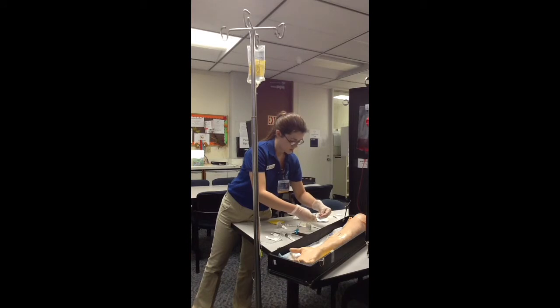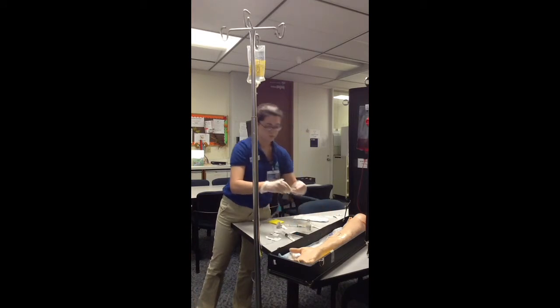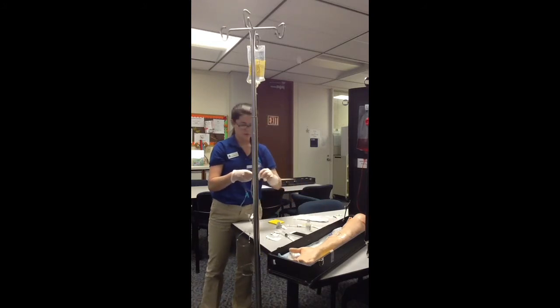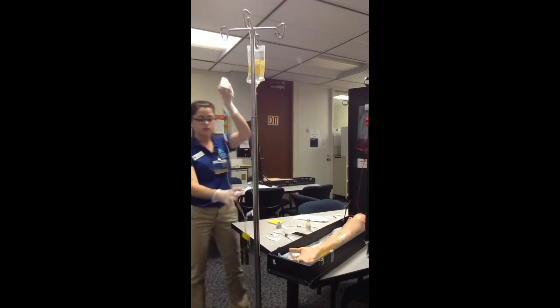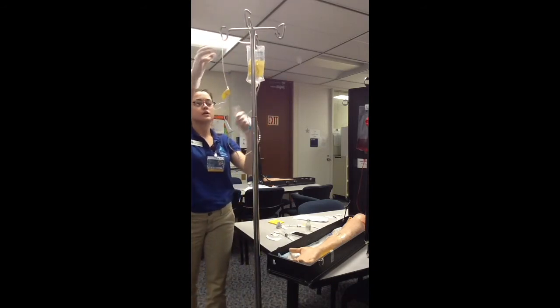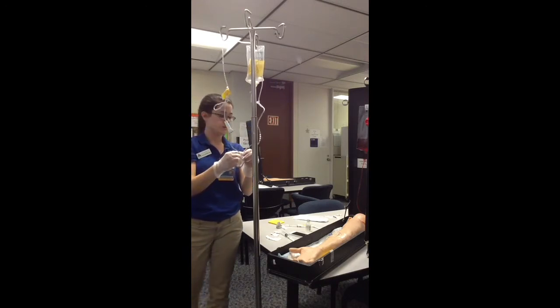And I'm going to put a new needleless device on for the next nurse. And I'll leave it in the wrapper that it came in so they know it's new. And my medication tubing is dated, initialed, and timed.